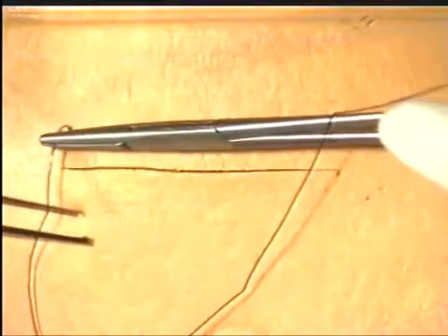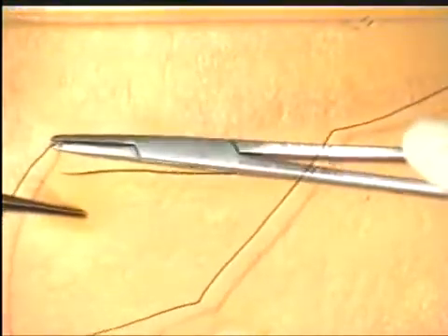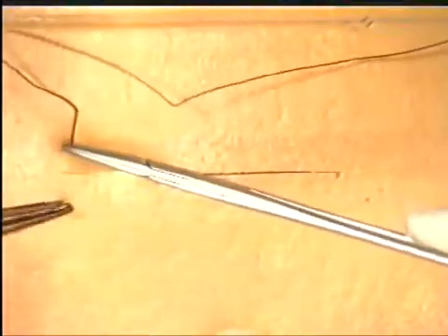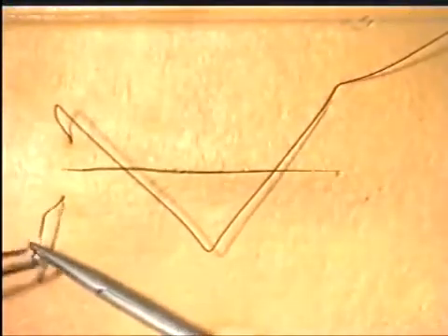Mattress sutures can be inserted to allow for eversion or inversion. They can also be used for irregular skin edges. We will demonstrate here a vertical mattress suture.